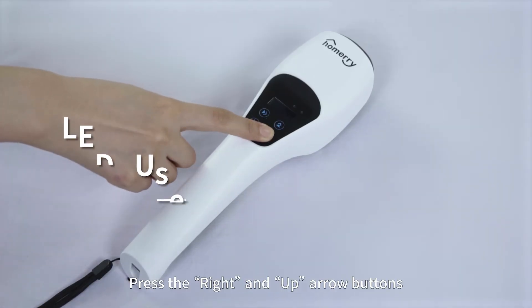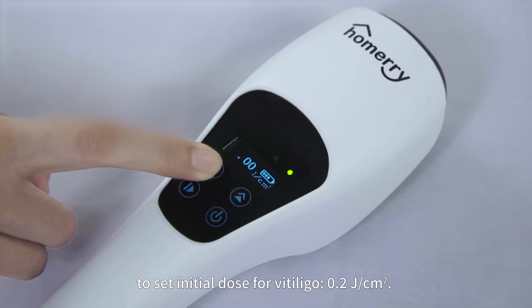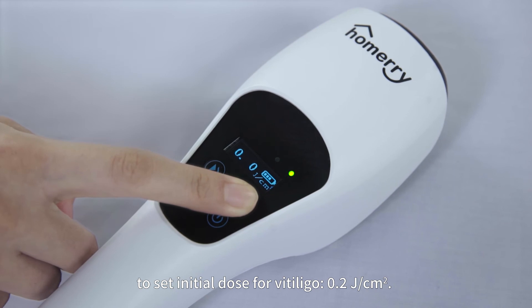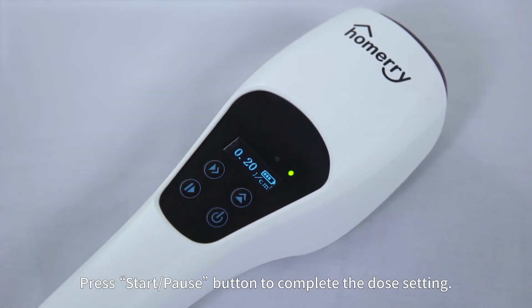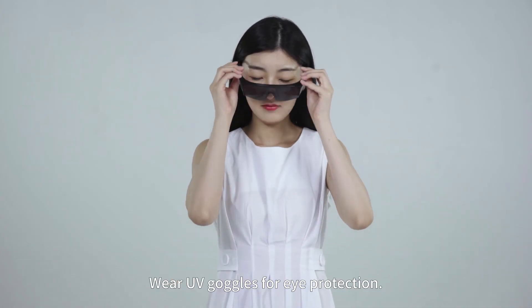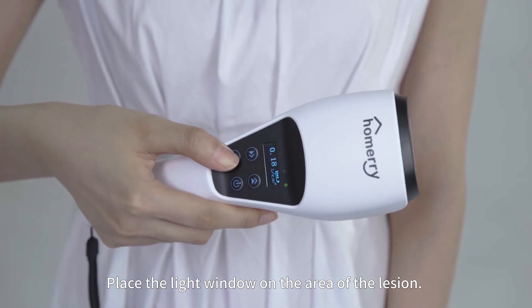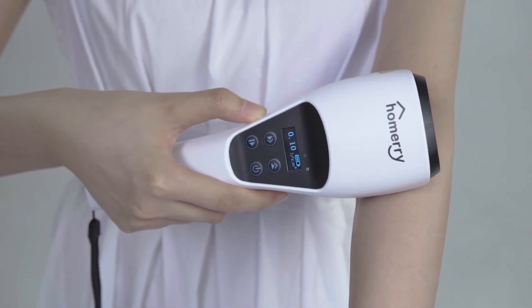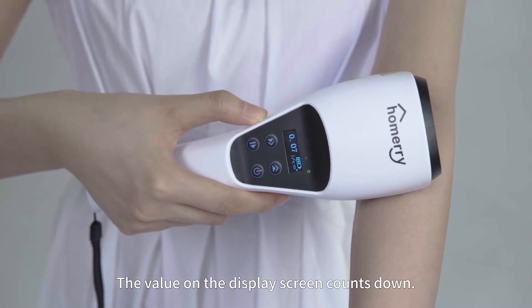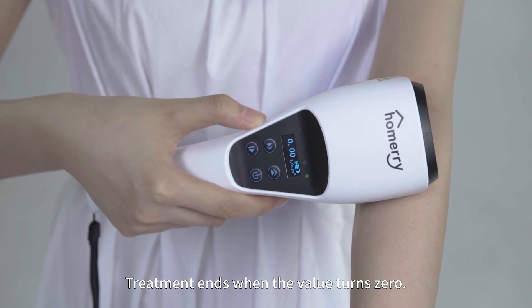Taking vitiligo treatment as an example: turn on the device, press the Right and Up Arrow buttons to set the initial dose for vitiligo of 0.2 joules per square centimeter. Press the Start/Pause button to complete the dose setting. Wear UV goggles for eye protection. Place the light window on the area of the lesion and press the Start/Pause button to start the treatment. The value on the display screen counts down; treatment ends when the value reaches zero.